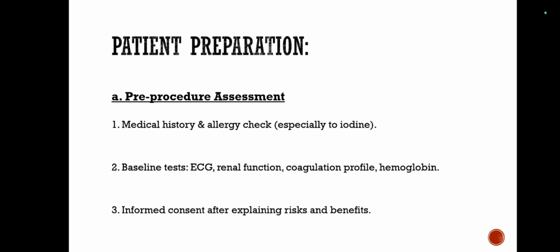The third one is the informed consent. We have to explain the procedure, its risks and benefits to the patient, and we have to get legal consent from the patient before the procedure.